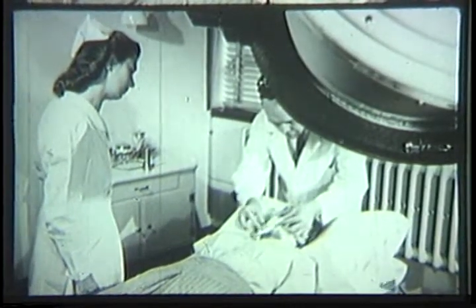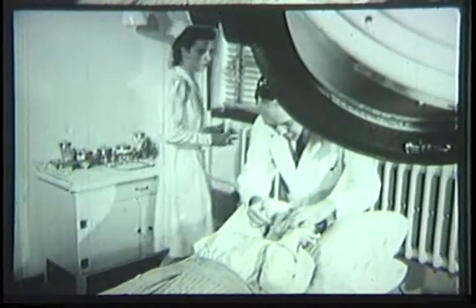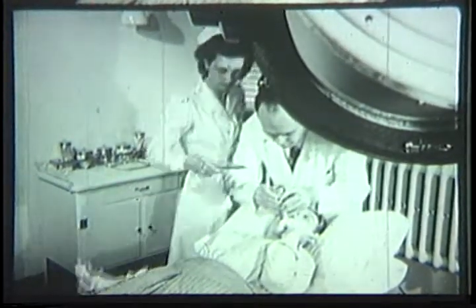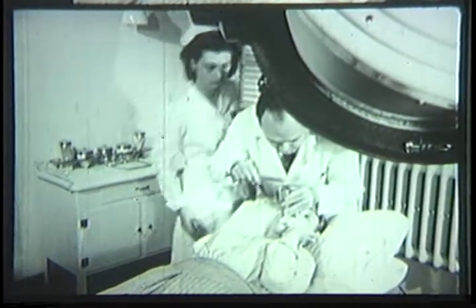The doctor holds the tongue in position with gauze. The technician gives him the clean cone he had previously selected for Mrs. Gordon's treatment. A flashlight provides a preliminary check of the accuracy of its placement.